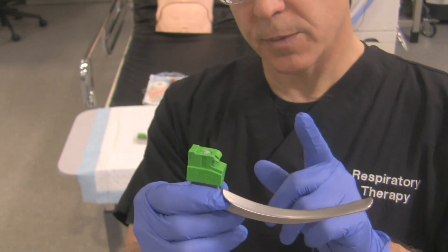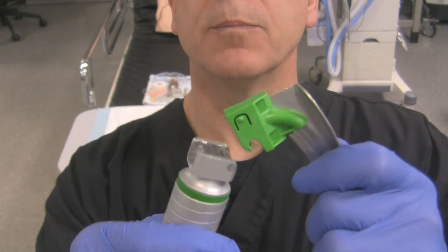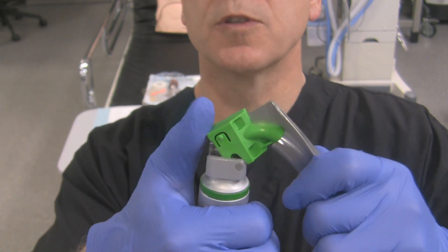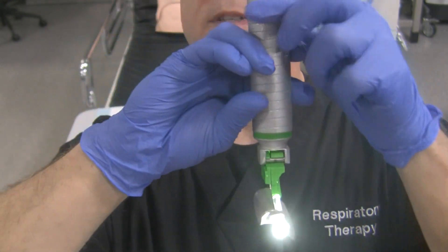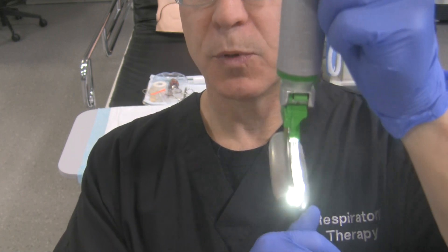To attach it properly, simply line the two together. You can see the bar and the slot — they attach like so. Put your thumb on top and push. Click — the laryngoscope goes on, is functional, and you haven't got your fingers in any pinch points.